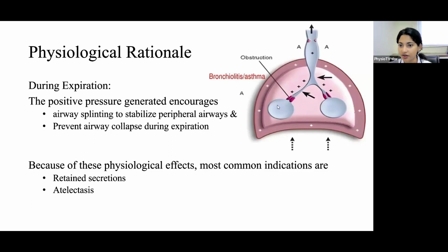So with positive airway pressure, with the patency of the airways staying open for a longer period of time, the remaining air can be effectively expired out as well. Based on these two main physiological rationales that occur in inspiration and expiration, this technique is applied mainly in cases where there are chances of retained secretion accumulation, and in cases where there are chances of atelectasis.